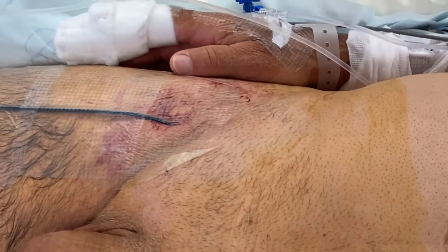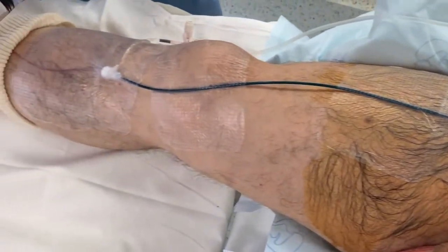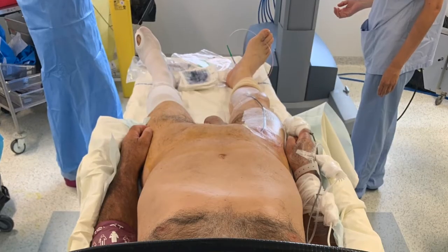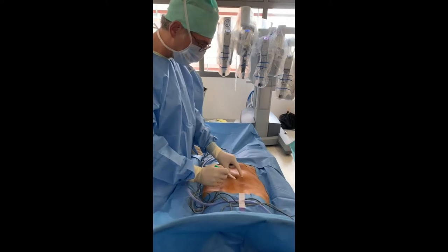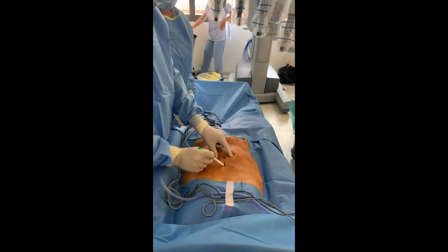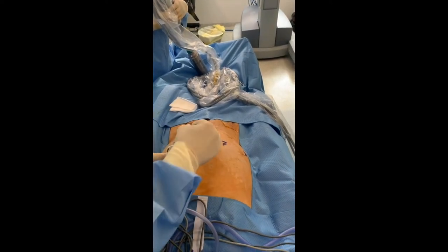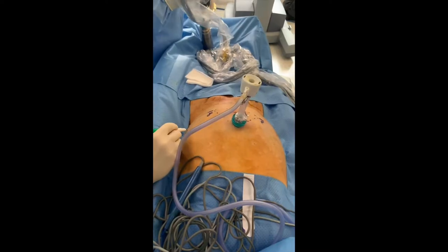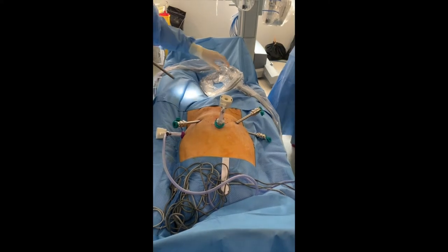The patient is then transferred to the operating room, ready for the robotic procedure. The robot is placed similar to a pelvic surgery, with the camera trocar placed above the umbilical hole, two trocars on the same horizontal line, the 4th arm on the right iliac fossa, and two assistant trocars in the left iliac fossa and right between the camera and arm number one.